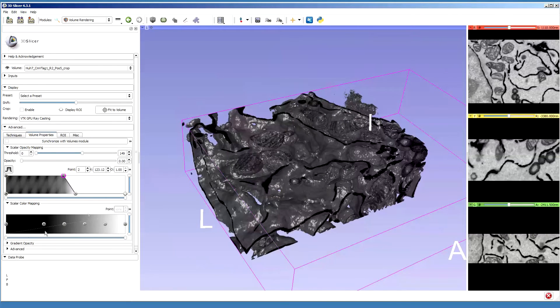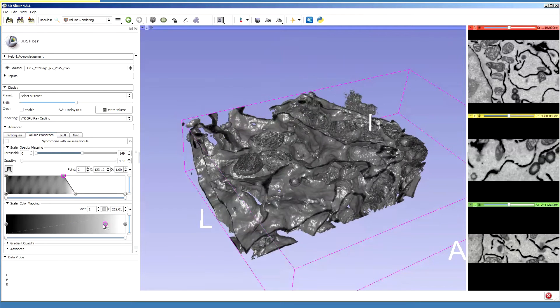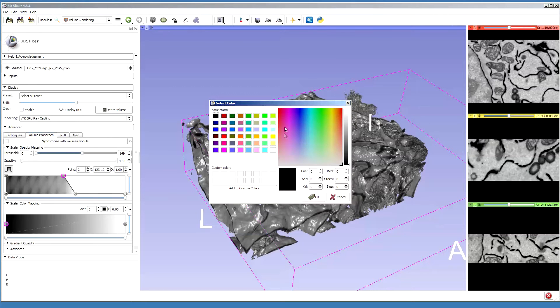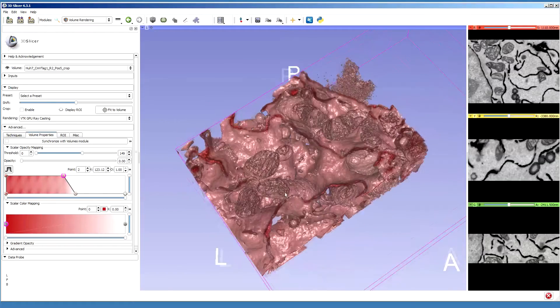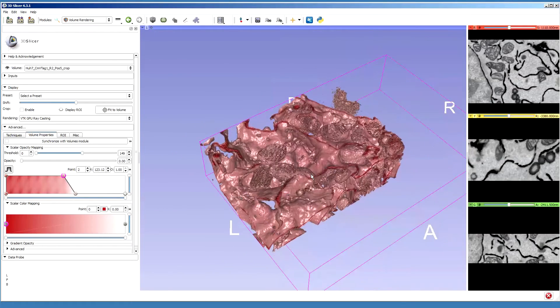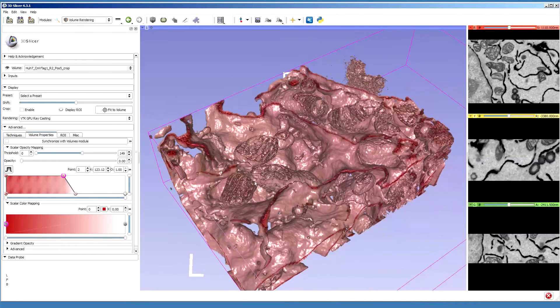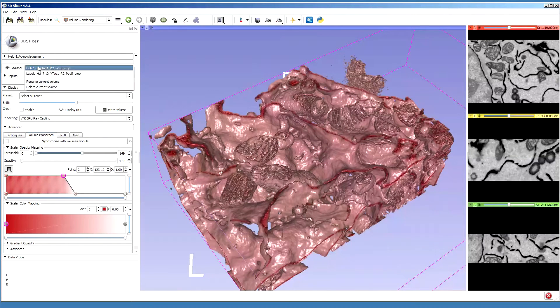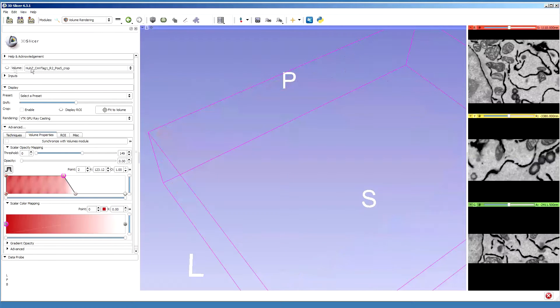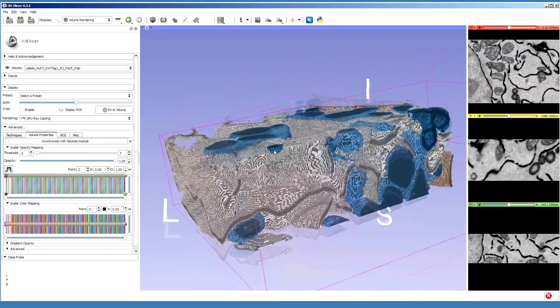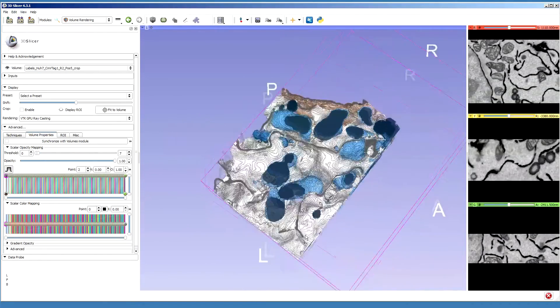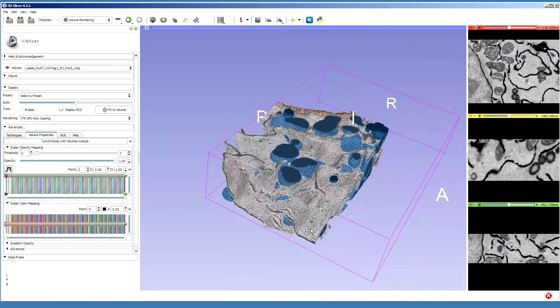If we want to change the color, we can do it in this lower part where we can remove intermediate points and define this point to be red, and then the color of this volume will be changed. Alternatively, we can use the same mode to visualize our labels. In the volume menu we select labels, and then that will allow us to see the labels of our model.